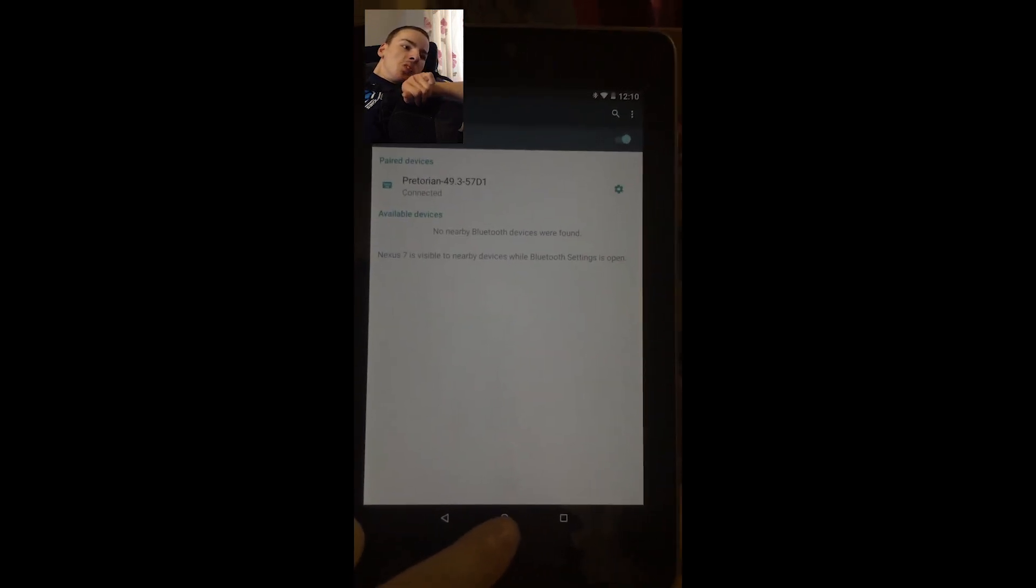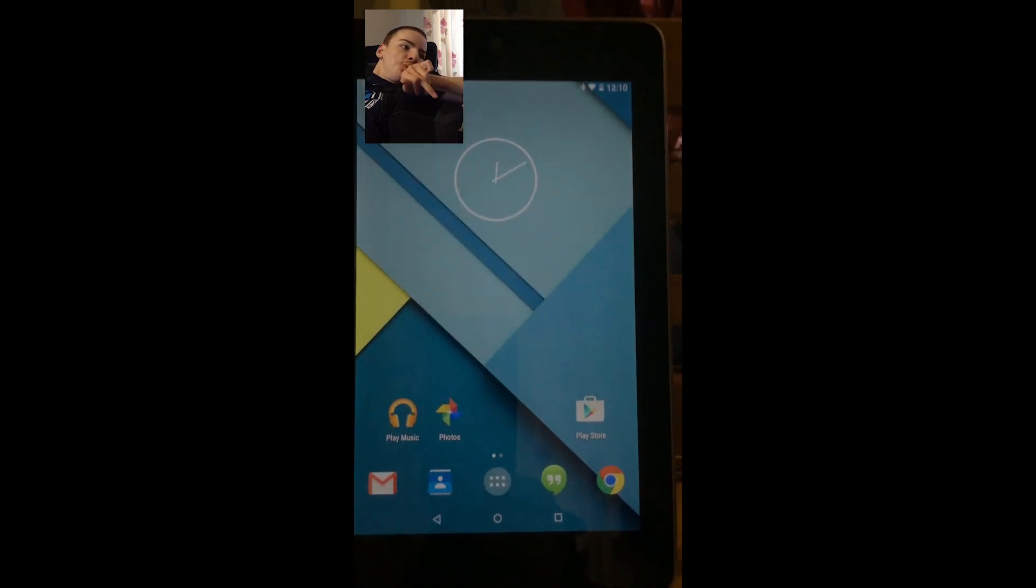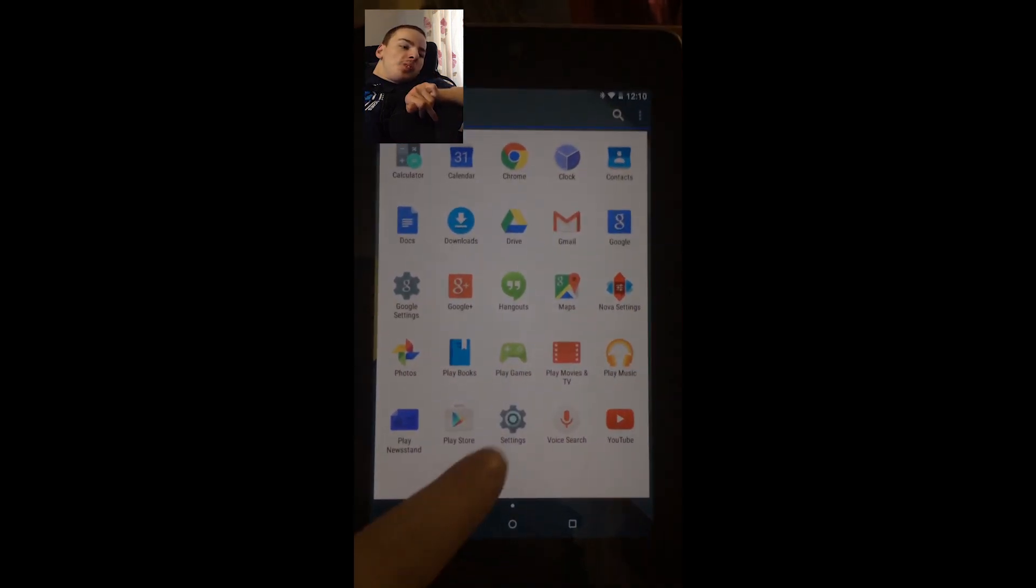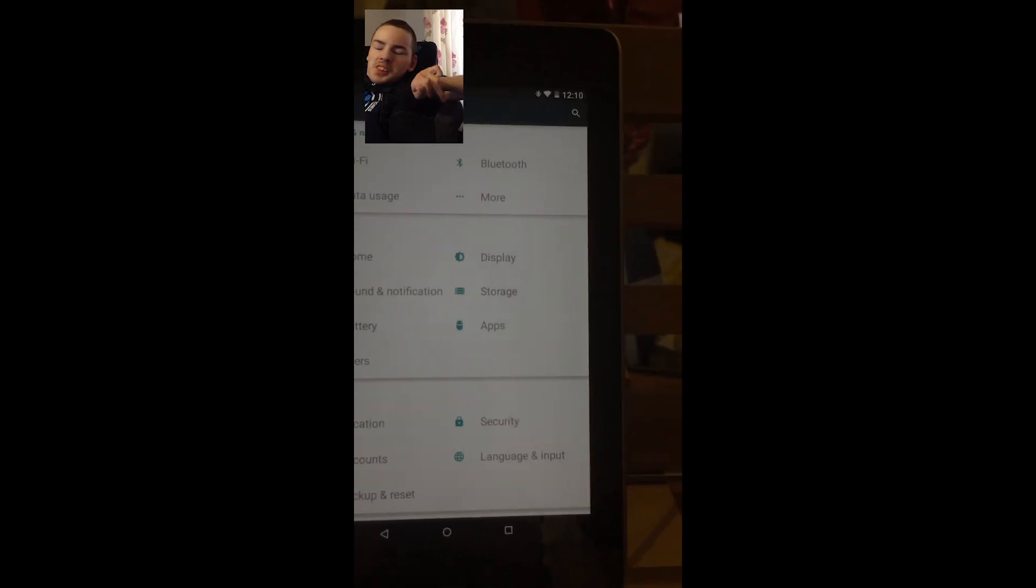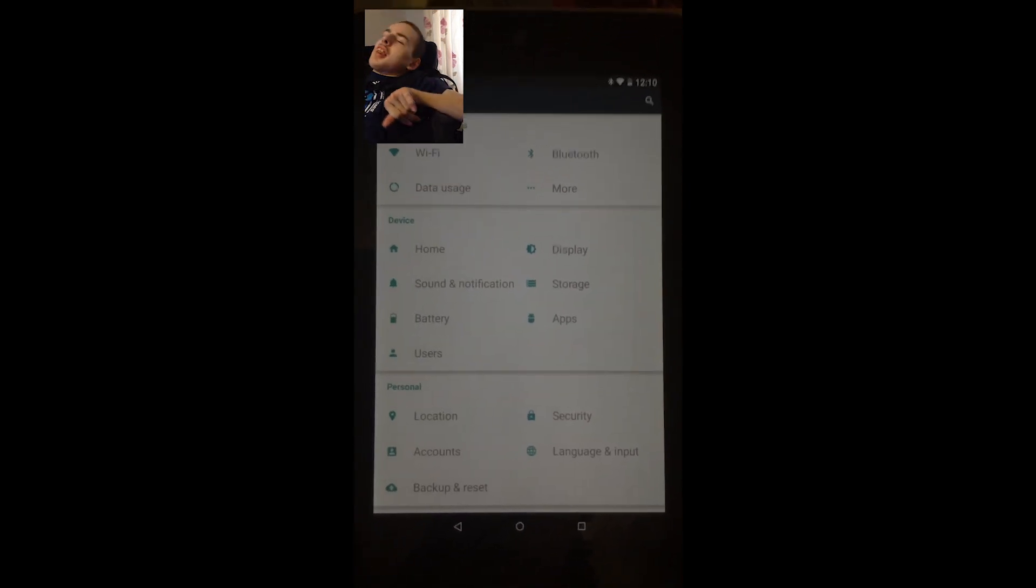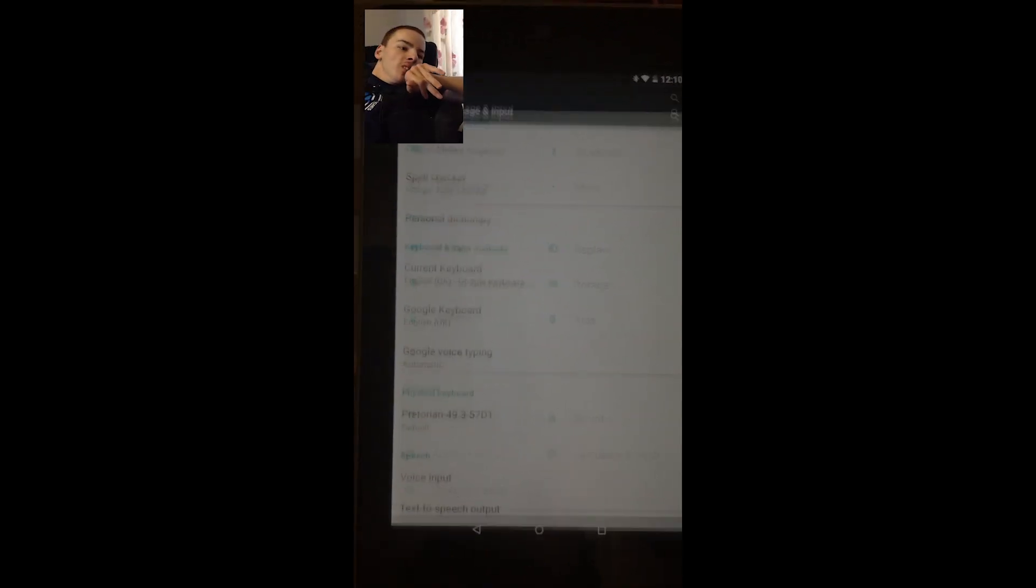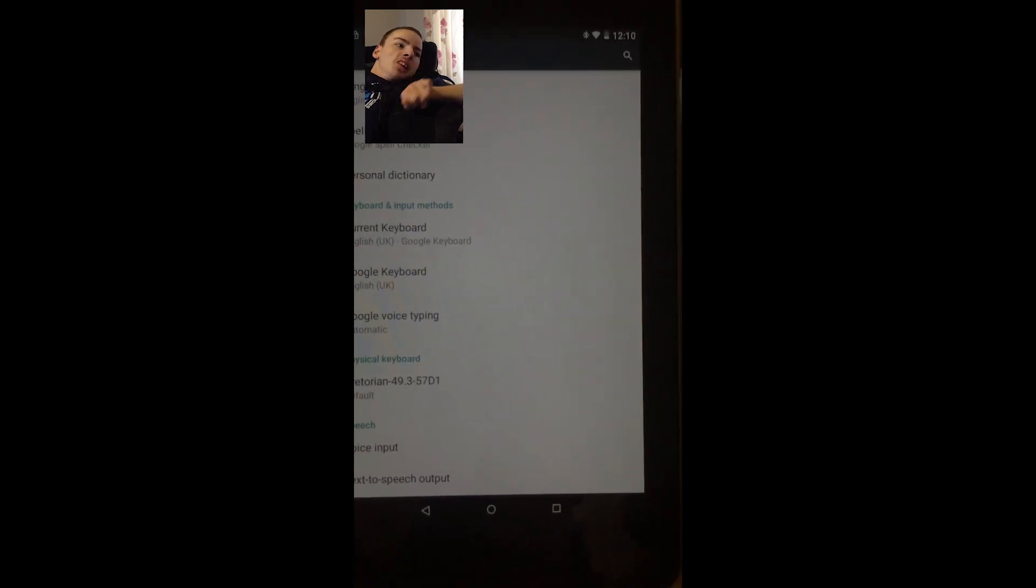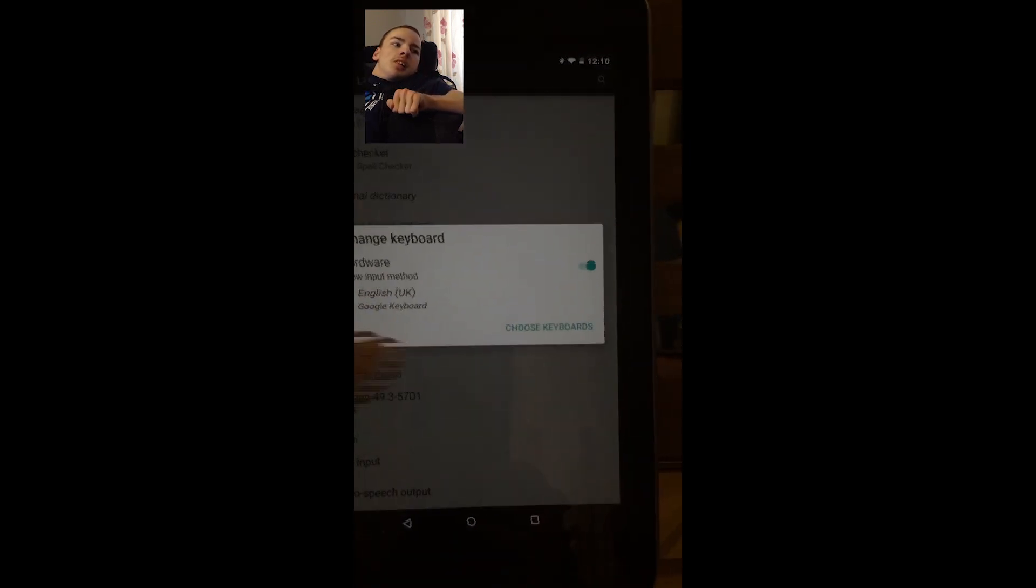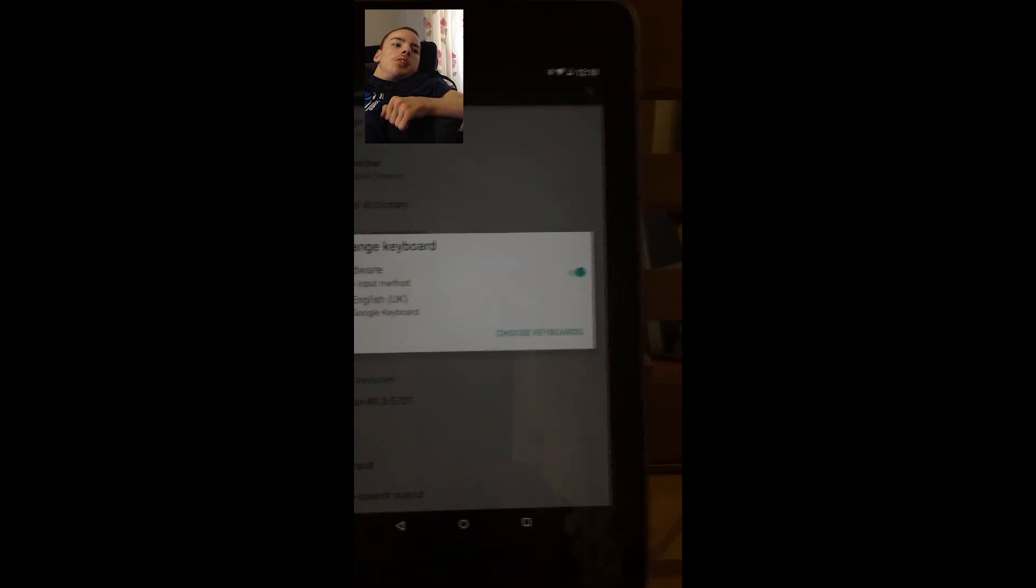So we'll go back to the home screen now and into settings again. And what we've got to do now is actually enable the on-screen keyboard again because it actually recognizes the applicator as a keyboard. So that is switched on there, so that's fine.